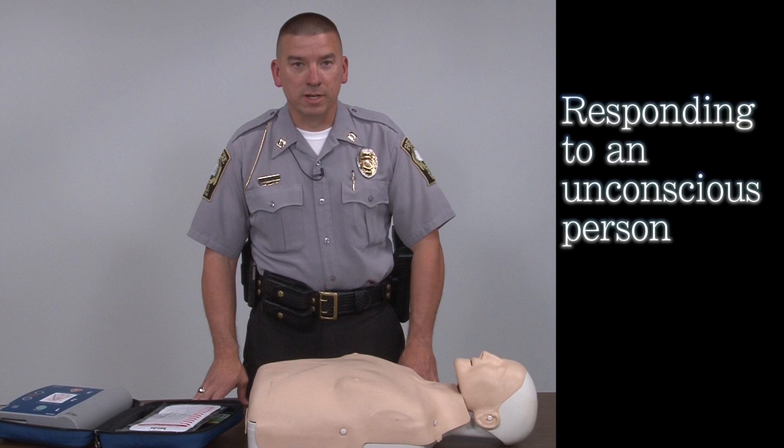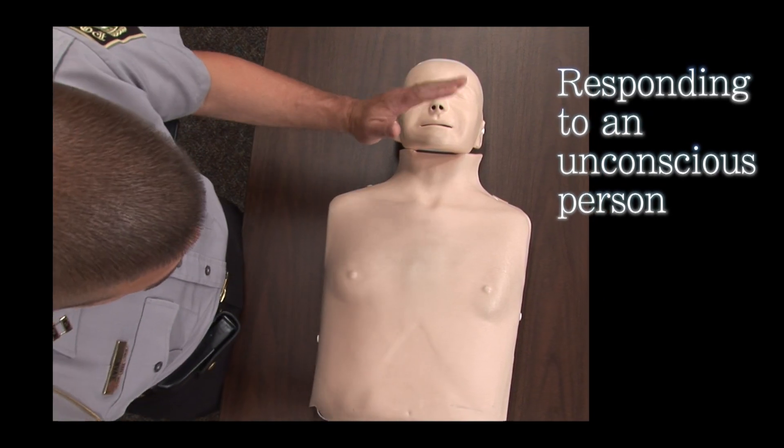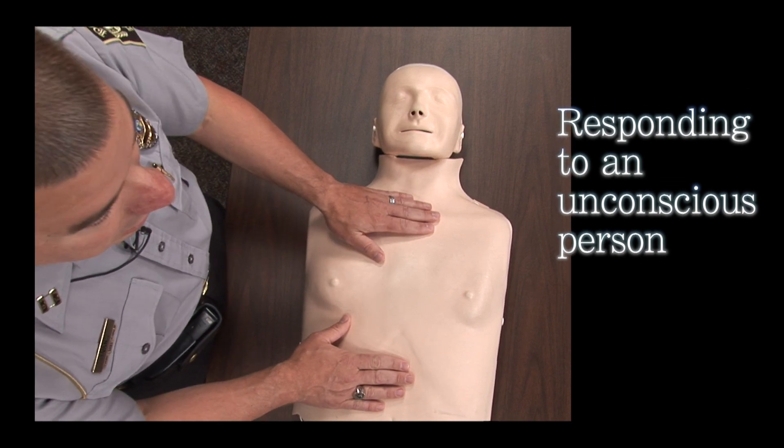First thing when you respond to a person that is unconscious, you want to make sure they're not passed out. So you need to come up, shake and shout — hey, you okay?